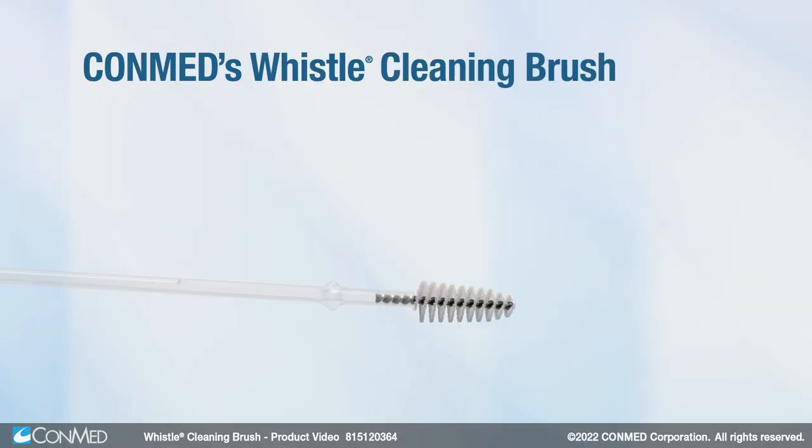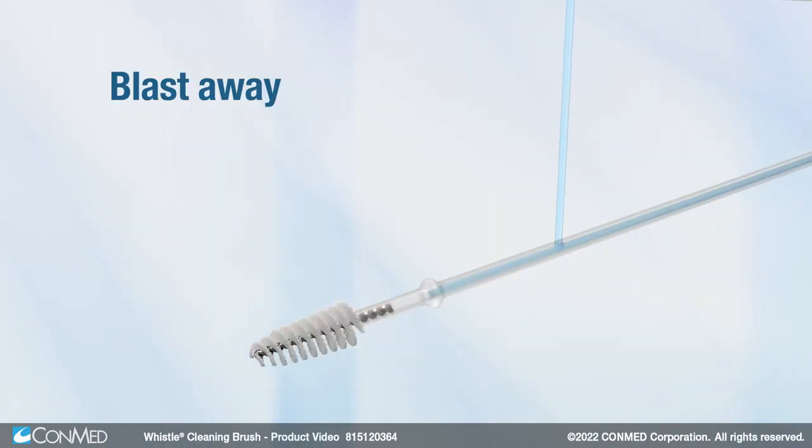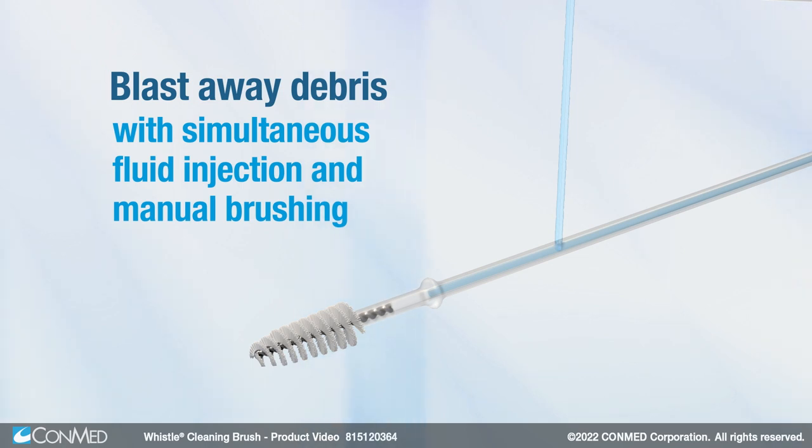CONMED's Whistle Cleaning Brush is an economical cleaning solution compared to purchasing disposable duodenoscopes. Blast away debris with simultaneous fluid injection and manual brushing.